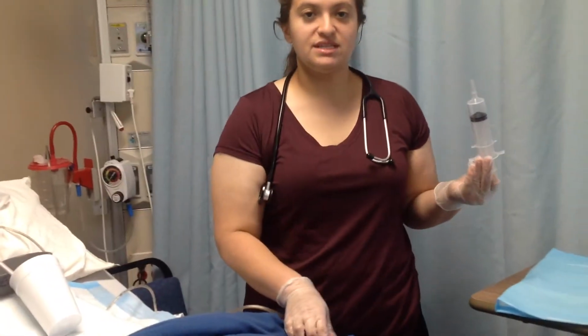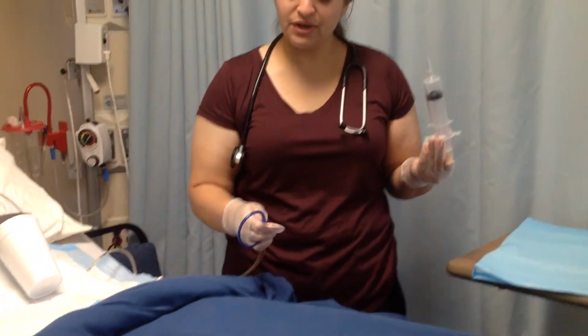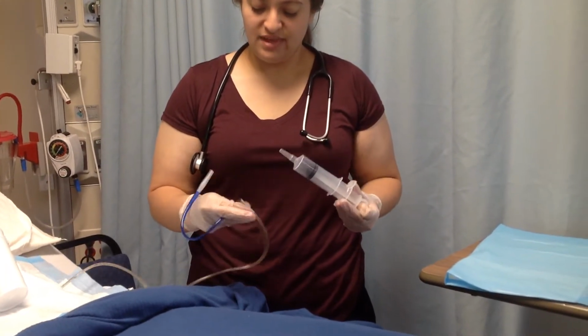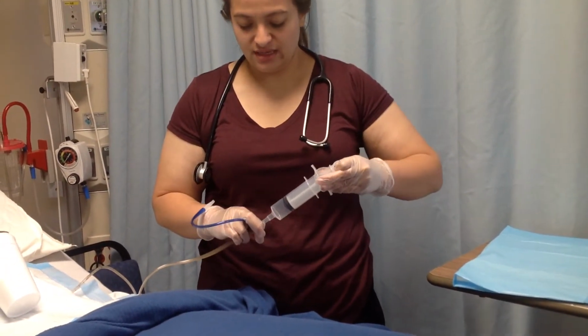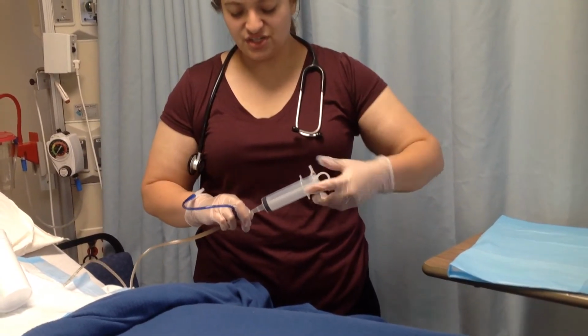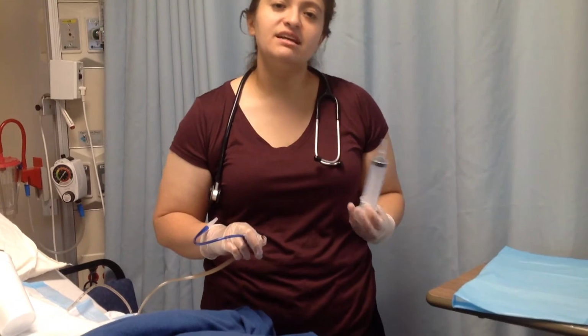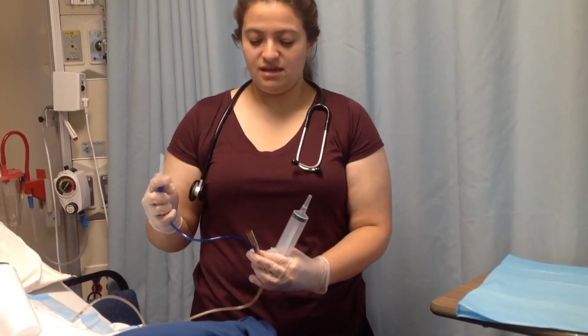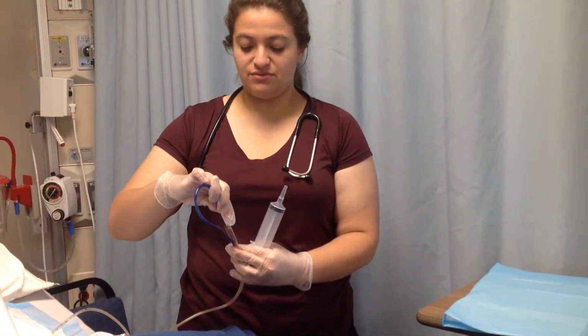So now that I have my solution, I would cap it again, and slowly insert the solution. This is just to irrigate any bacteria or anything that might be stuck, any residue. And I want it to run clean. And I would cap it back up.